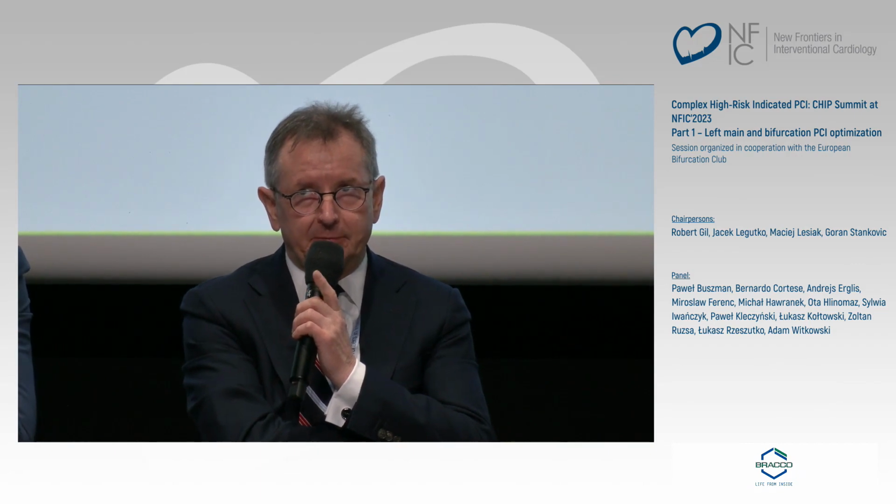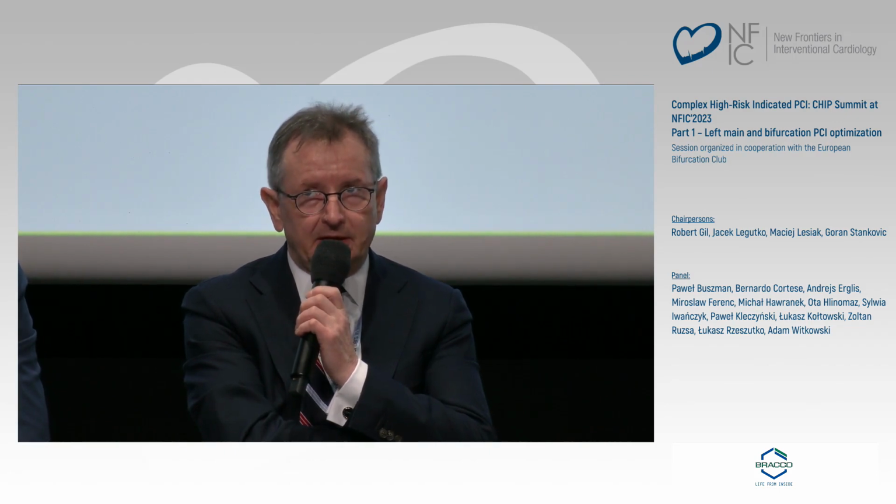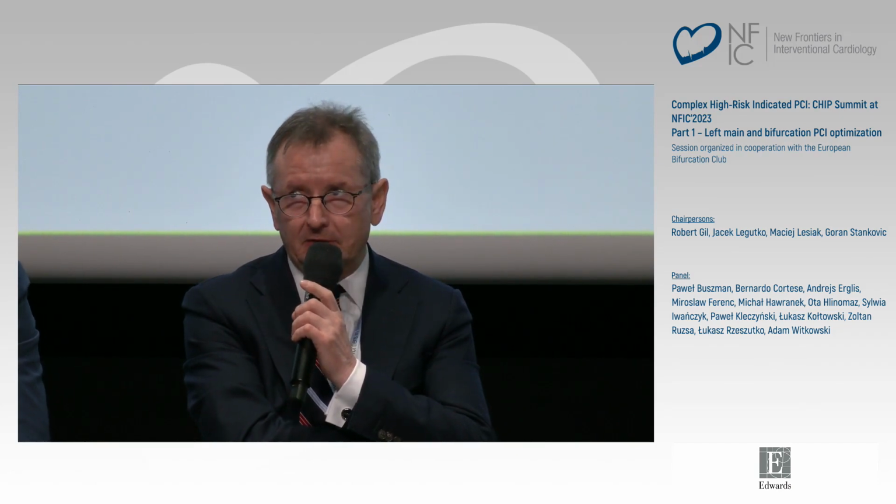This will be alternative, because it's definitely not a case for debulking techniques. You can't use here orbital atherectomy or rotablator. It's just the case for ballooning. And if you don't have IVL, I think OPN will be suitable alternative. What do you believe?